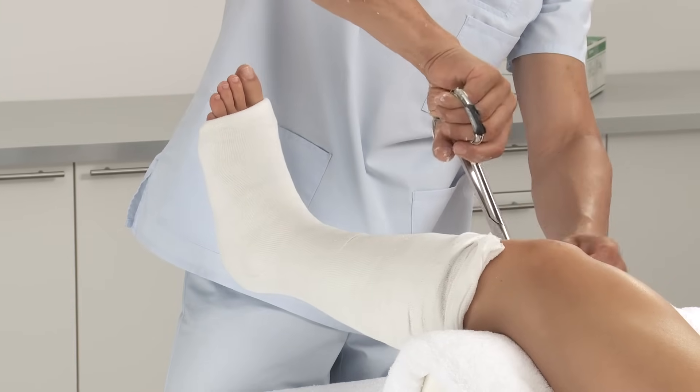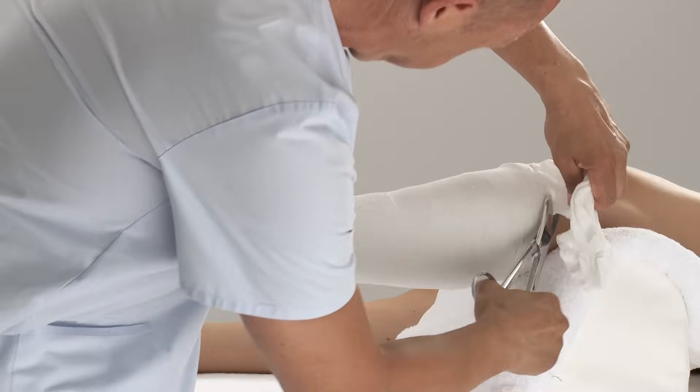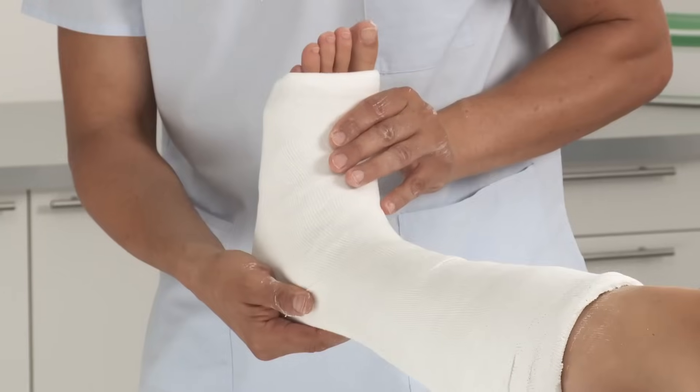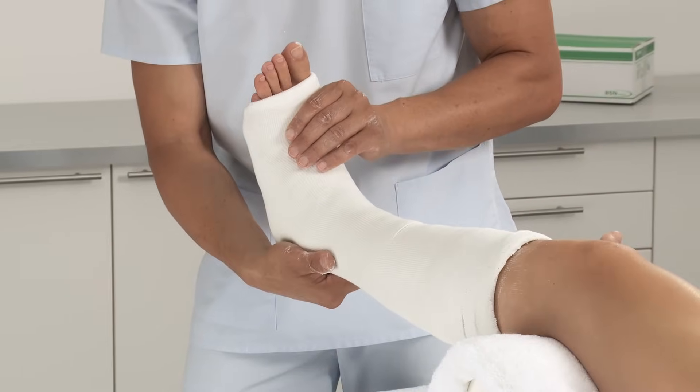Trim any excess. Check the desired range of motion and any points that may cause irritation or pressure. After approximately 3 to 5 minutes, the cast is set and the patient can be released. After 24 hours, the cast is fully set.